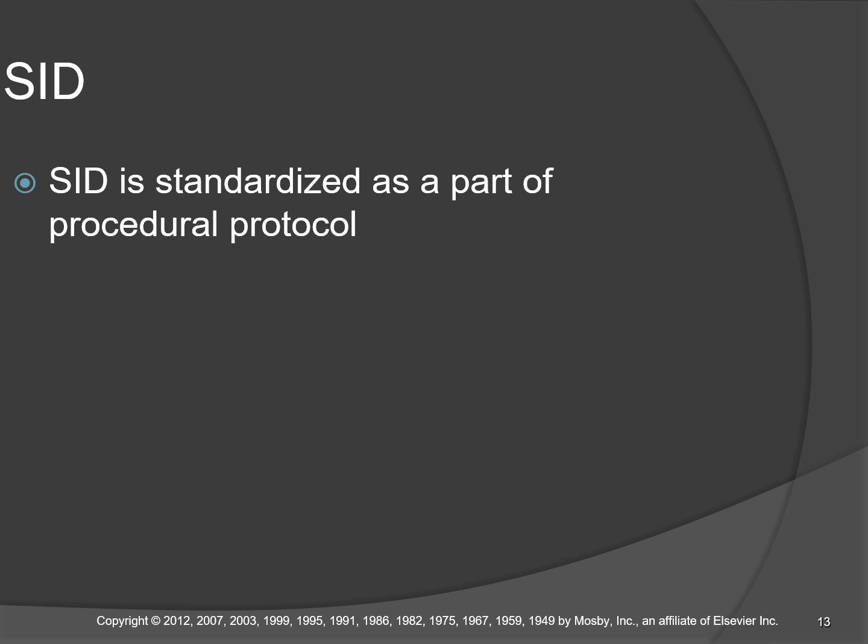First of all, your modern digital equipment, I don't think the portable machines, but the modern digital room won't let you shoot. It'll disable the exposure unless you're exactly at 40 inches or exactly at 72 inches. So, yeah, the portable machine, as far as I know, you can dream up any SID you want.